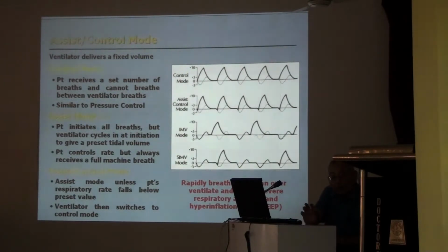So when I am put on a ventilator, the machine will work as a watchdog, because the machine has a flow sensor and all varieties of gadgets. They will monitor how I am breathing.